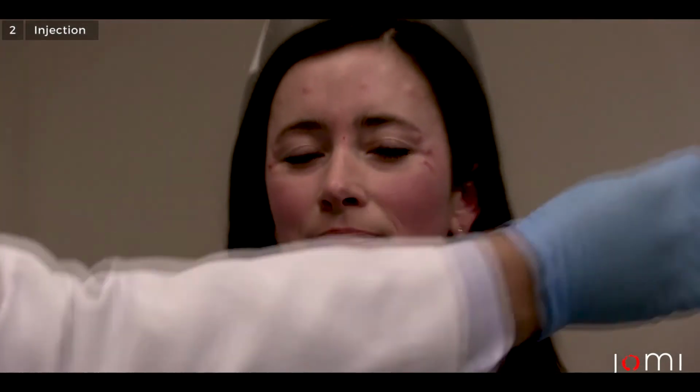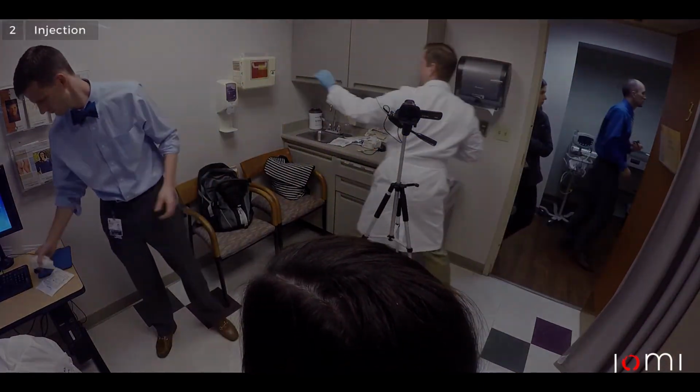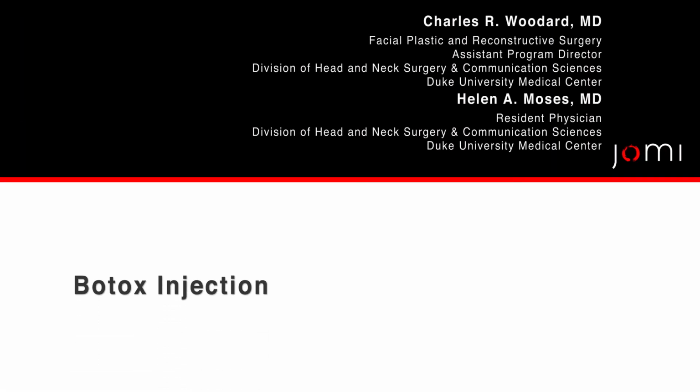All right, that's pretty much it. And so now we'll have the patient ice. That was a total of 40 units we used for her, which I think is appropriate, since we reduced the amount of product that we put in the glabella region relative to our typical patient, who would be perhaps a little bit older prior to this injection. And that should do it. Thanks.